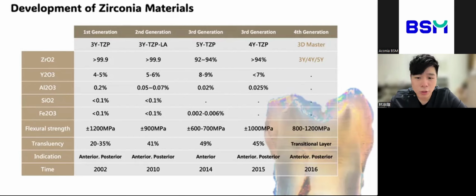In the past, translucency was around 20%, but today it's closer to 45%, 41%, even 49%. At this level, the zirconia starts to behave more like lithium silicate or glass ceramic. And we face similar problems when it deals with a dark or discolored abutment. Later, I will also talk about how to manage this color problem and what options we have in this situation.